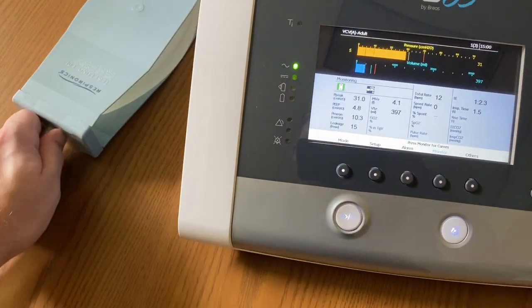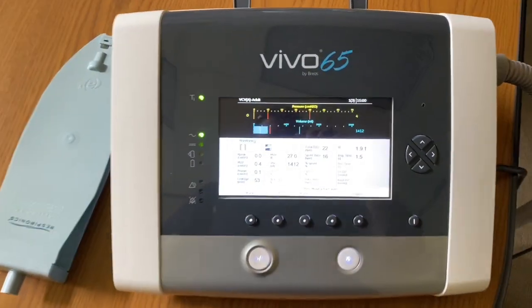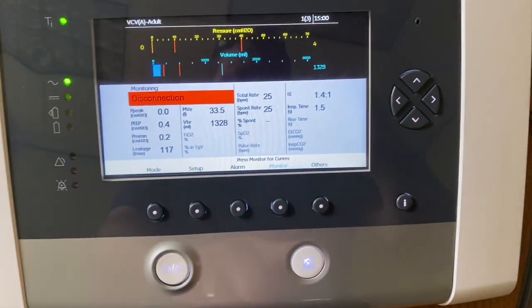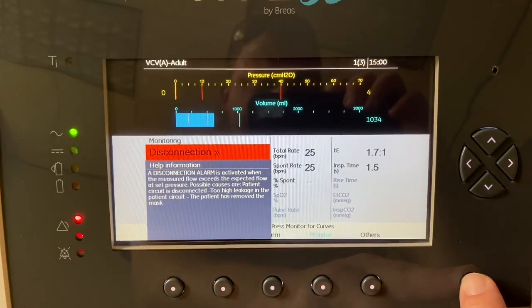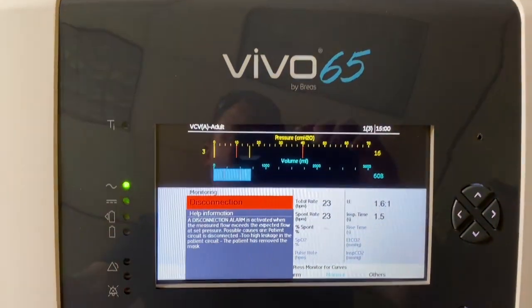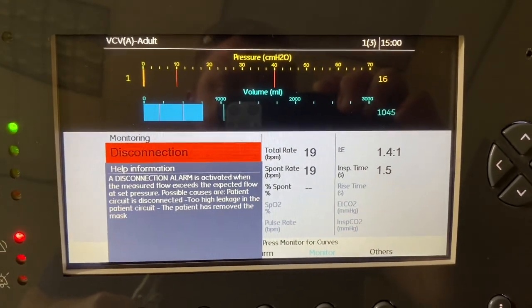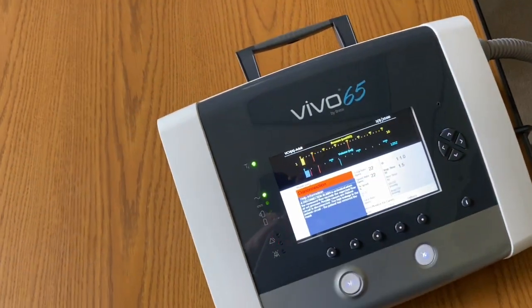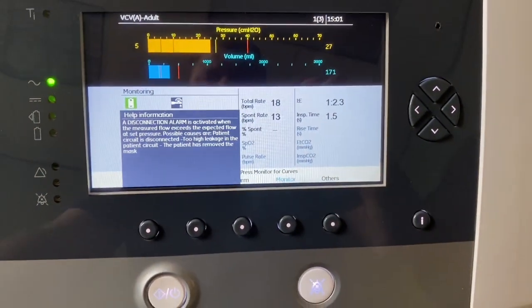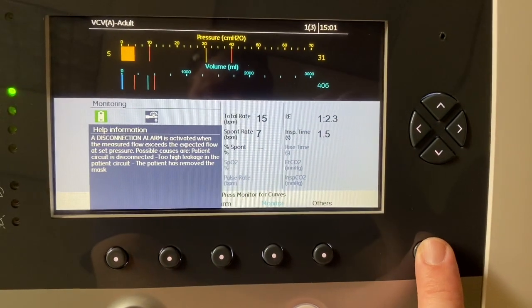Anytime you do have an alarm — I'll go ahead and disconnect this from the patient — it's alarming disconnection. You'll notice you have this information screen. If you press on information, it can give you helpful tips on what the alert means. It's like a little troubleshooting advice for the therapist if they're not quite familiar with what the alert is prompting them, what's going wrong, and how to fix it. I will connect my patient back, fixing the disconnect, and my alarm is now resolved. Press information again to get rid of the tip screen.